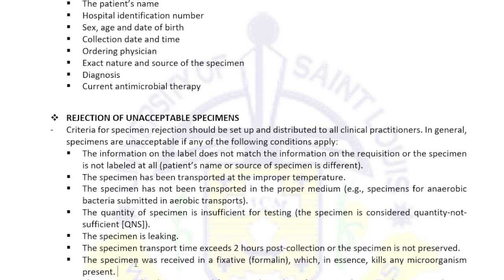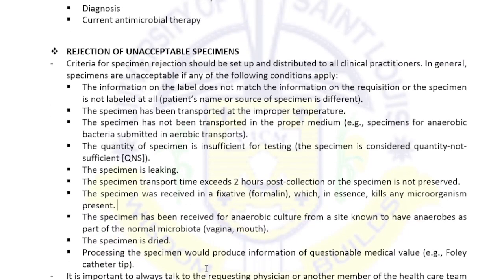Okay? The specimen was received in fixative. It should be rejected. Why? Kasi the formalin, the fixative, kills the microorganism. Ano pang i-culture natin? The specimen has been received in anaerobic culture from a site known to have anaerobes as part of the normal microbiota.